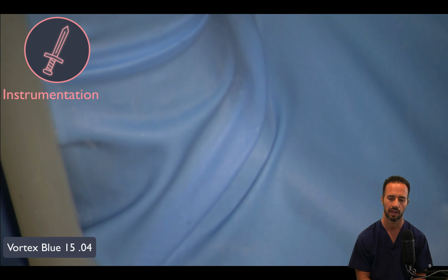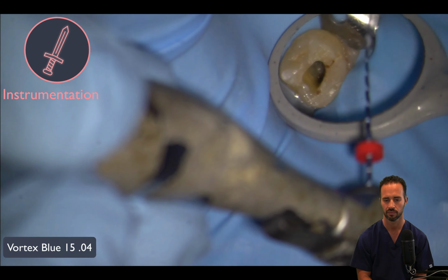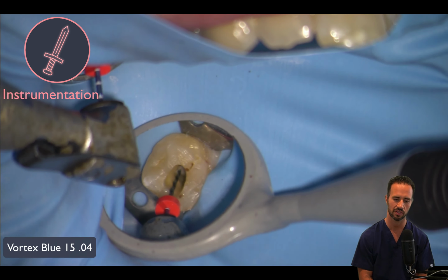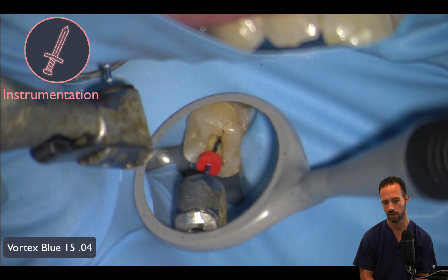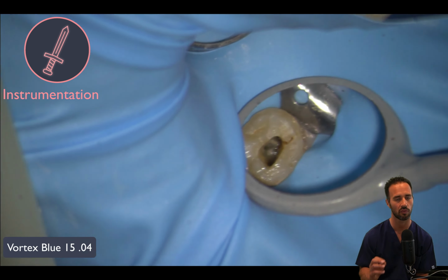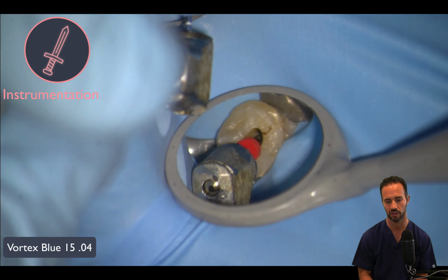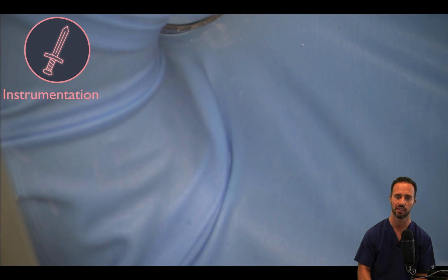then into our distal buccal at 19 millimeters. And I'm trying to give you a really centered view here, so that's obviously slowing me down a little bit. That's okay. And remember, just a few pecks. You don't want to go too aggressive. If it's not taking you to length, don't force it as usual. Let the file do the work. The technology on these files is outstanding, and they're going to do the work for you, unless you're not supposed to be progressing because there's some sort of obstruction, in which case you're going to go down to hand files.